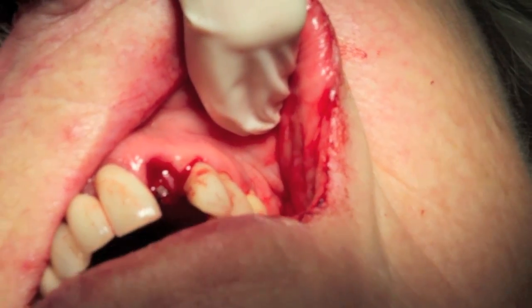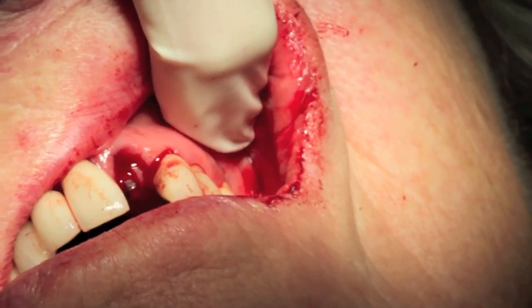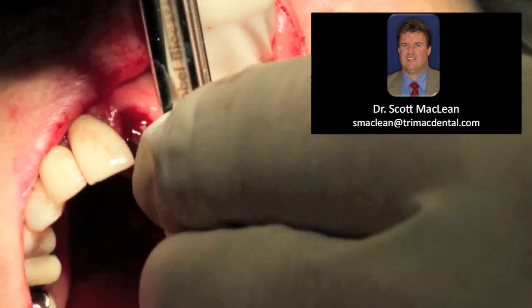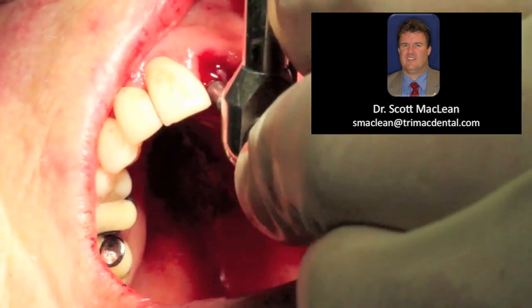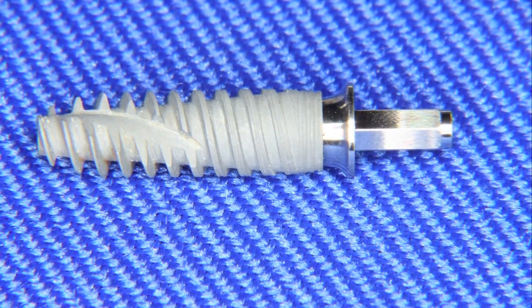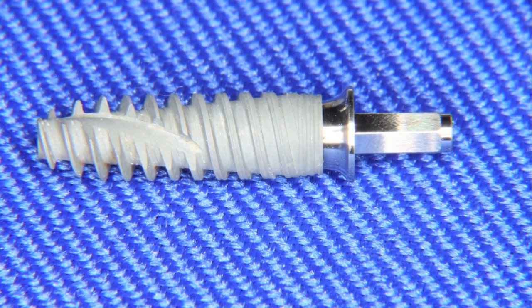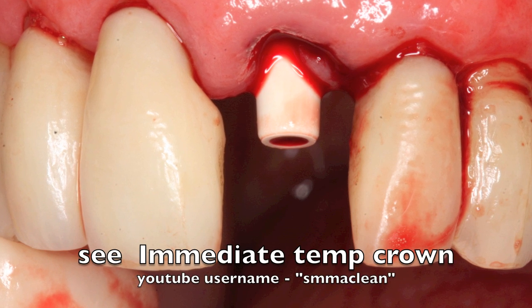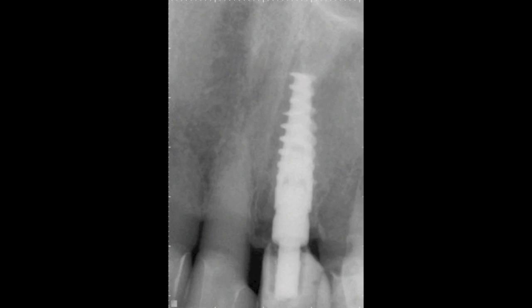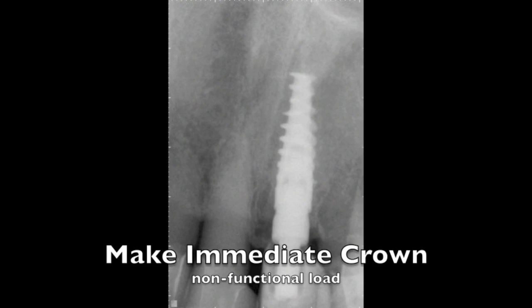So here we're just checking the occlusion to make sure that there's enough space, because you can get a 3.0 millimeter immediate temporary abutment, which is a little bit longer, and then we're going to torque this down. Once we torque it down, we're able to put on the white cap. So you can see here's a picture of the implant with the abutment on top, and this is what you're looking at. So we'll make our immediate temporary crown, and then we'll be off to getting this restored in about 3 to 4 months.